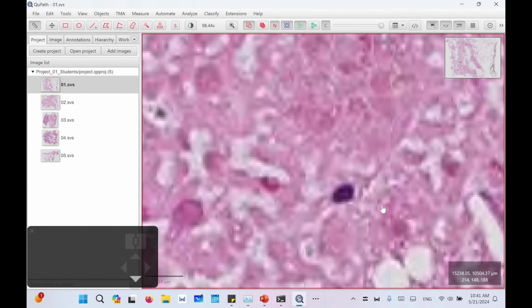You can also press on invert background, so it will be in grayscale, but it will change the black to white and vice versa. As you see here, the nuclei are converted to white and the background is converted in black. Let's return it to the original and uncheck for both of them. You can close that menu.